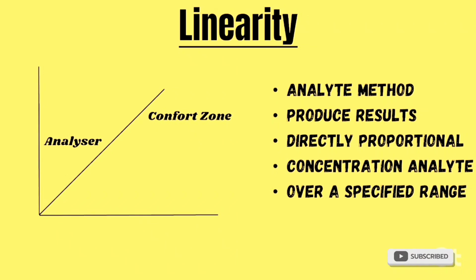So when you say linear, it means that there's a straight line, consistent with a measurement. When you say that something is linear in this context, you are saying that what I've gotten is within the expected target. Let's say, for example, think about your standard curve, which is actually what the linearity means. Before you run a test, you have to do the quality control.